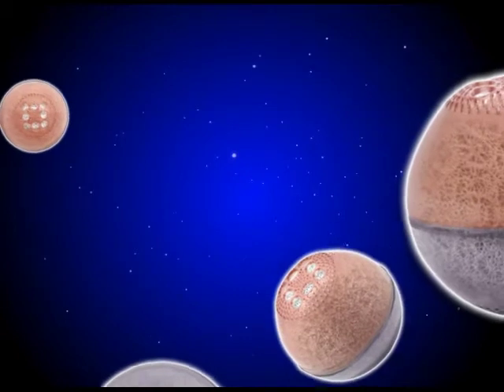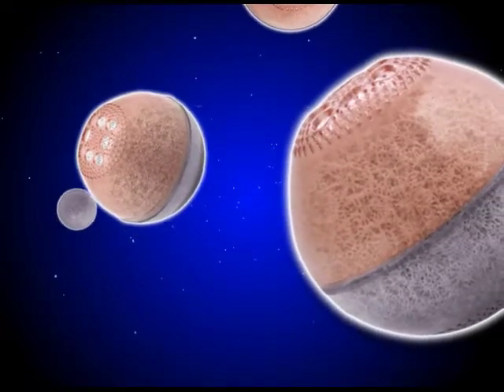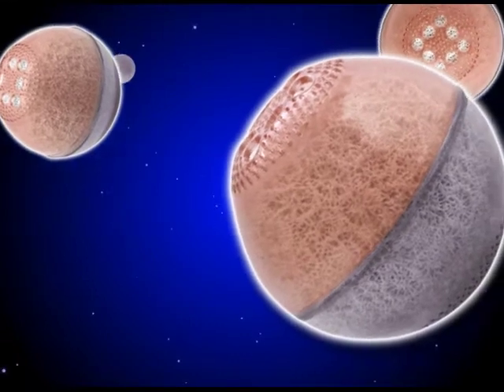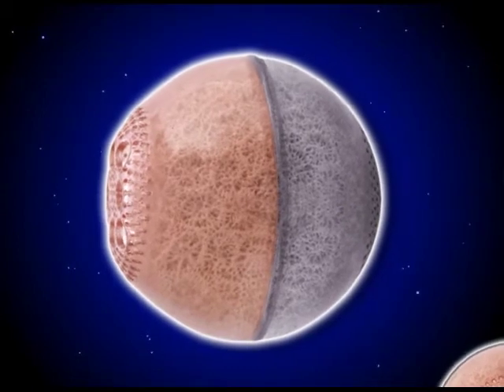The Perforated, Coated Bio-I Hydroxyapatite Orbital Implant makes the world's best orbital implant even better by making it easier to use, faster to implant, and a better value overall.